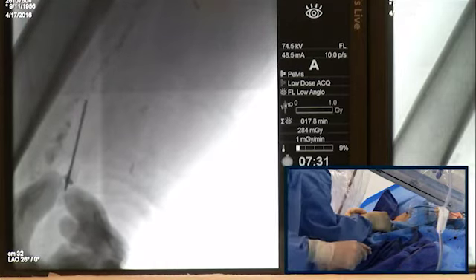Hold the wire for me. So again, you want to be as parallel as you can. Now, if you hit the vein again, you can go to a different location. Yeah, that's the vein again. Okay, that's fine. So I'm going to pull back here. Watch my needle.